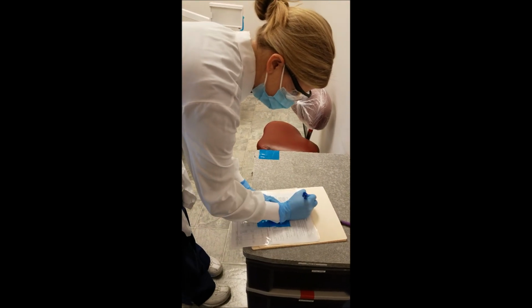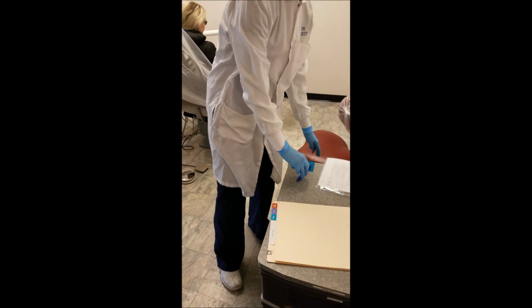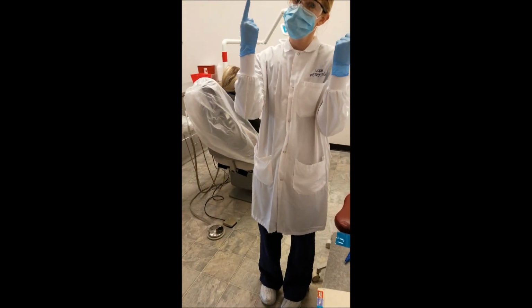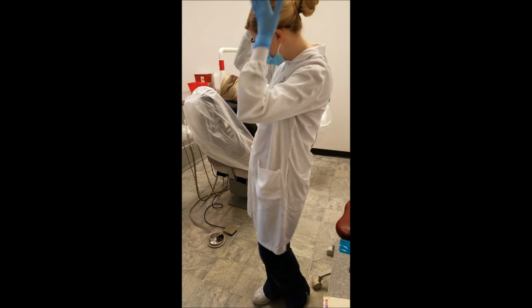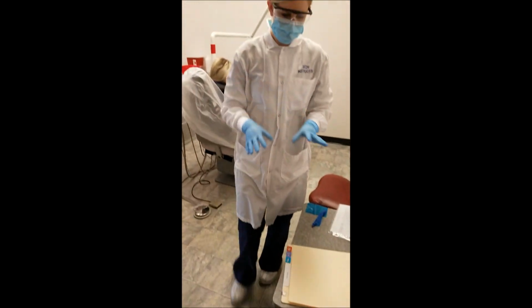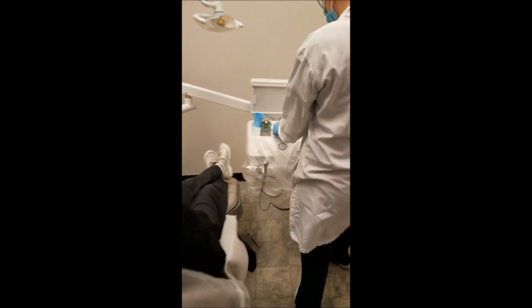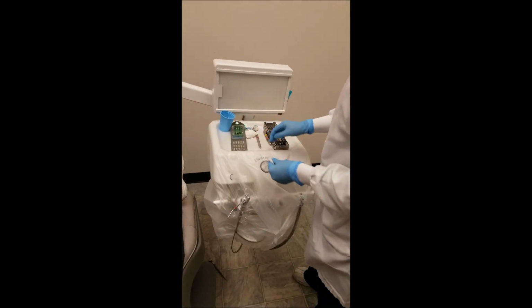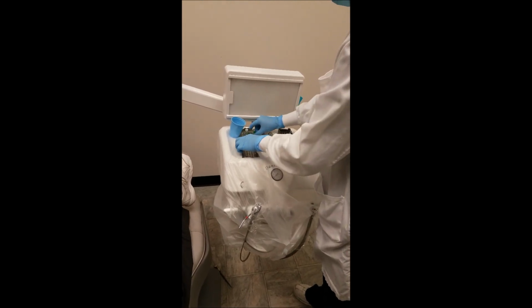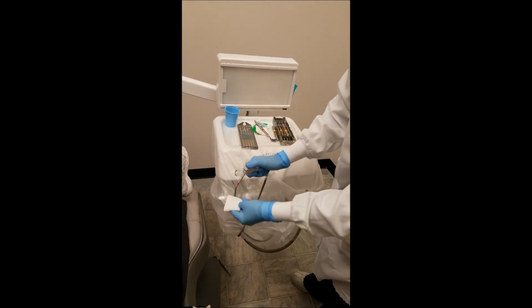She will avoid direct gloved hand contact with contaminated surfaces, especially but not limited to mask, eyewear, including loops and light, her hair, and the patient record. She will keep instruments clear of gross debris. She will keep a neat and tidy tray throughout the appointment. She will wipe the mirror face clean with a damp 2x2 gauze.